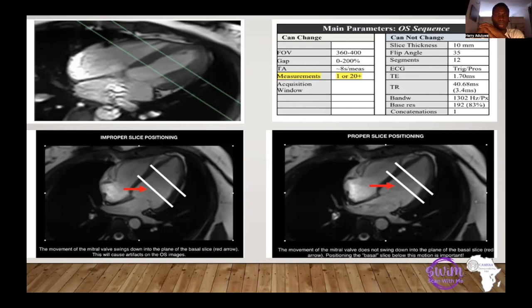So back to the oxygen dependence protocol. As part of this 4 minute protocol, you mentioned that the final part is a 40-second breath hold sequence. Yeah, perfect. I would like to find out if there is an alternative to that. The truth is, even if I do abdomen and pelvis breath hold sequences, even for 15 seconds, it's quite difficult for patients to hold their breath for 15 seconds. Is there any other way we can go around this?